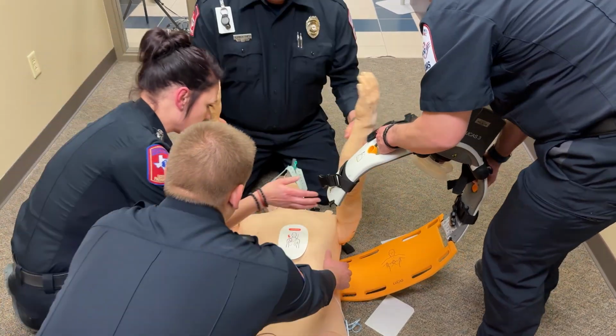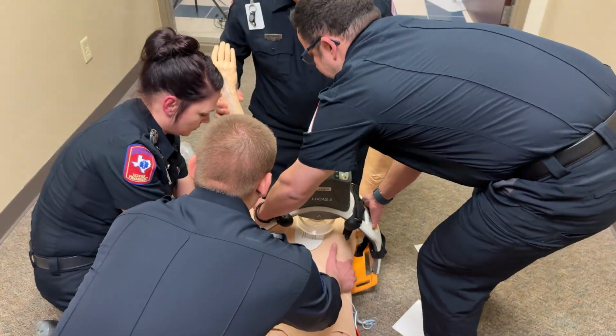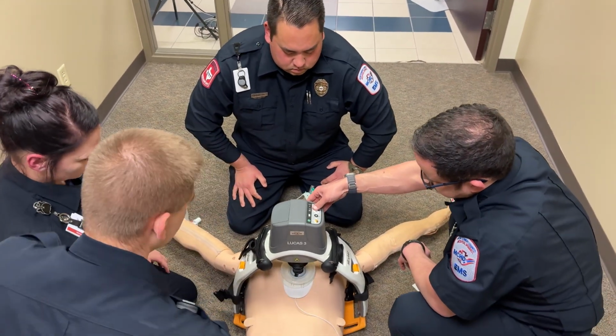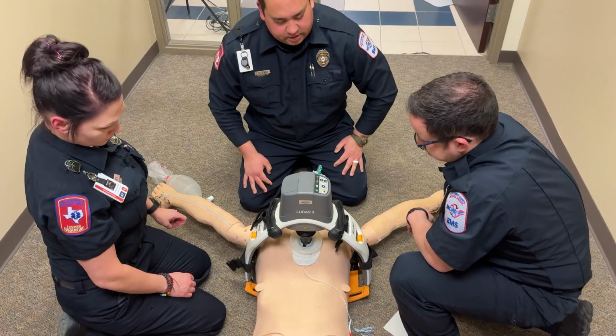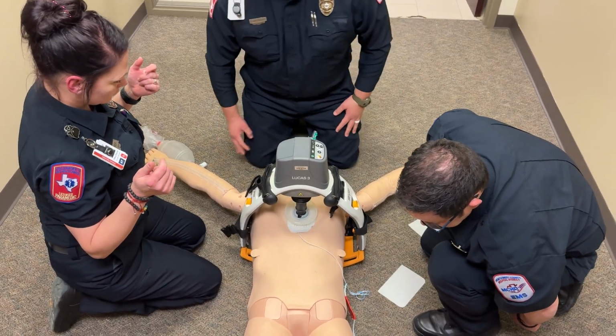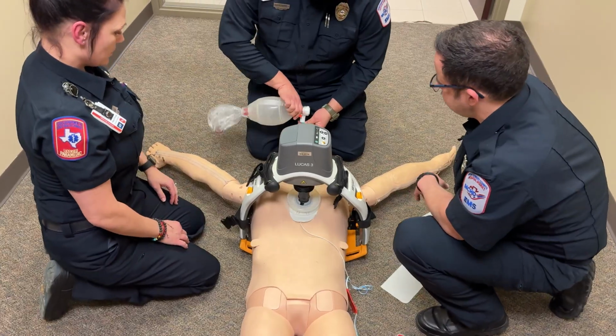Shock advised. Charging. Stay clear of patient. Deliver shock now. Press the orange button now. Shock delivered. Pause. Begin CPR.